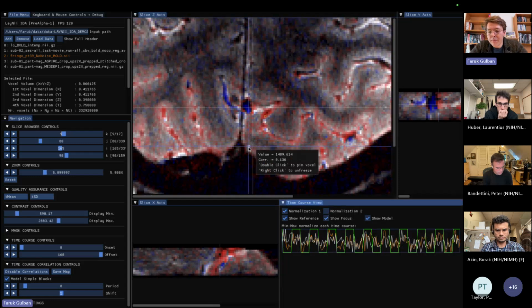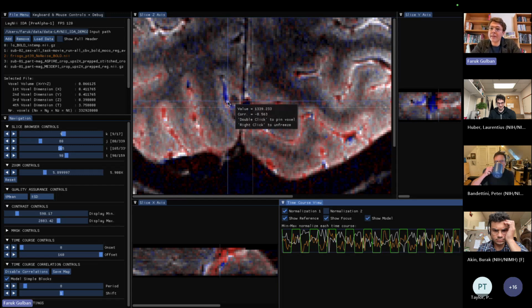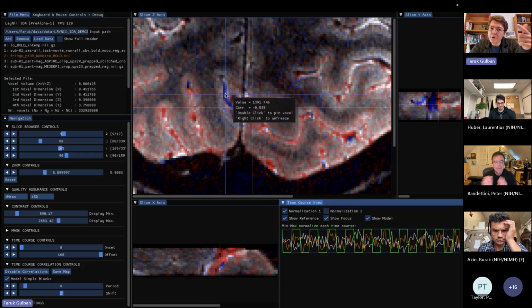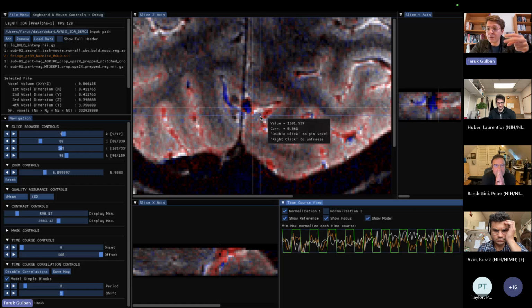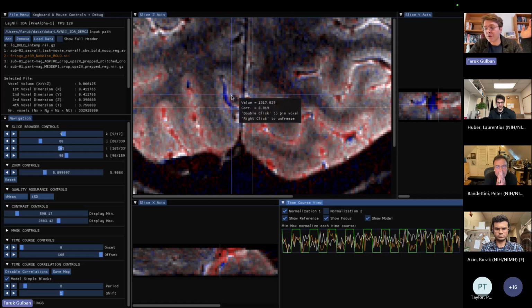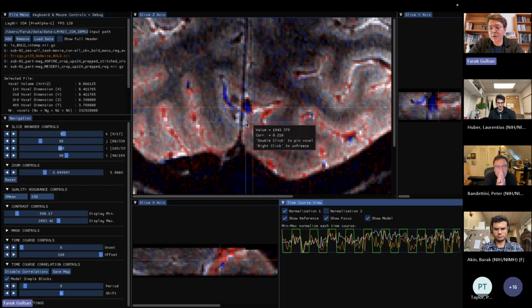So just to say that this whole cycle of looking at the anatomy at 0.35 millimeter, thinking of the 0.8 millimeter data, and coming back to the exciting 0.4 millimeter Frisco data, I think we have some, or at least for me, exciting avenues to explore with regards to how we can first be aware of these different signal activities, and two, can we leverage them? Maybe you can say, oh, if it's negatively correlated with my task, I just get rid of those voxels. But why? There's good information there. We can maybe leverage that information.